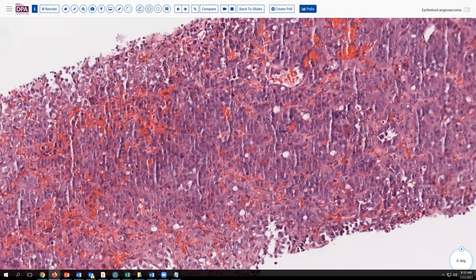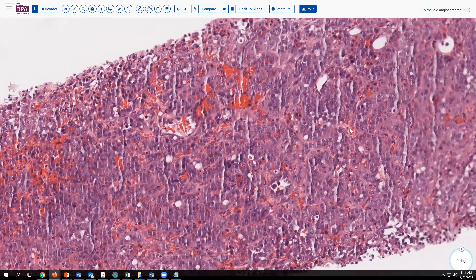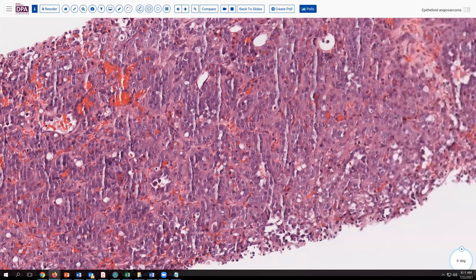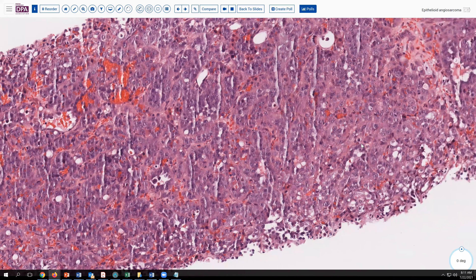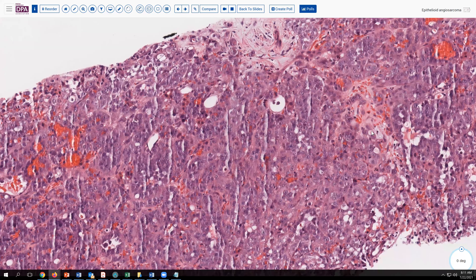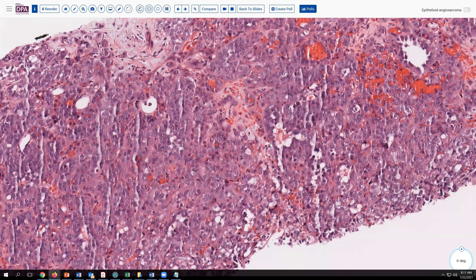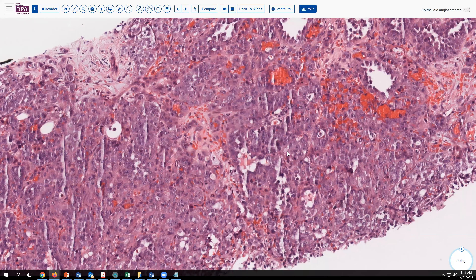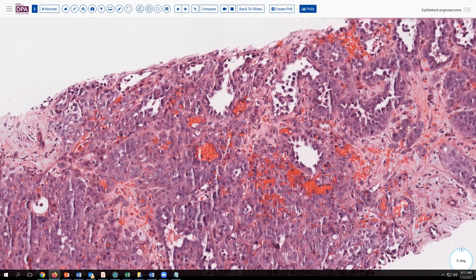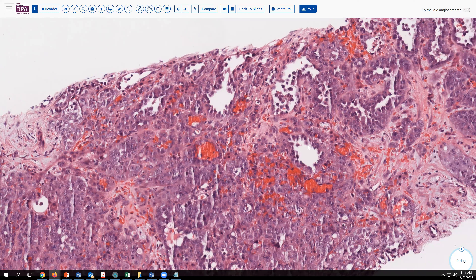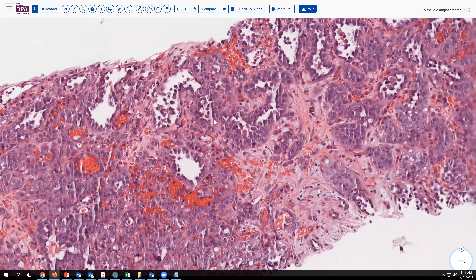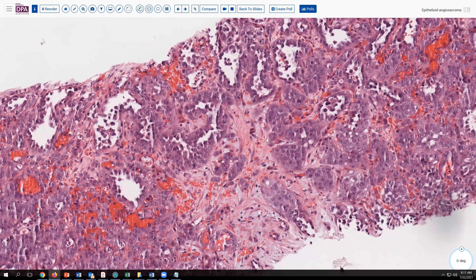This doesn't look like the usual fibrolamellar carcinoma — we don't see dense bands of fibrous tissue — but certainly the cells have a malignant appearance. A panel of immunohistochemical stains was done, which showed that these cells were not reactive for any cytokeratin: low molecular weight, high molecular weight, CK7, CK20 — anything of that sort was excluded. Because of the red cells, and also because we see these cavernous spaces with an almost tombstone-like pattern of cells extending into the lumina, the possibility of a vascular tumor was entertained.